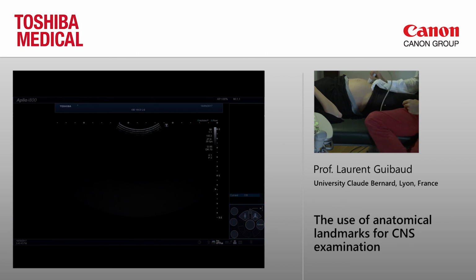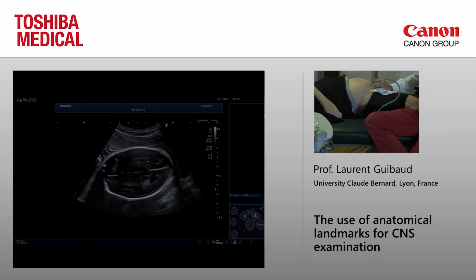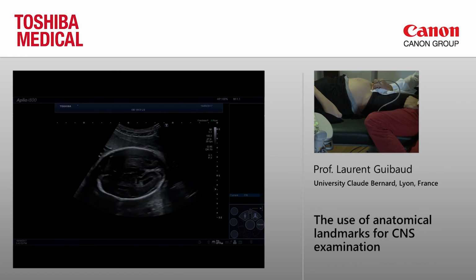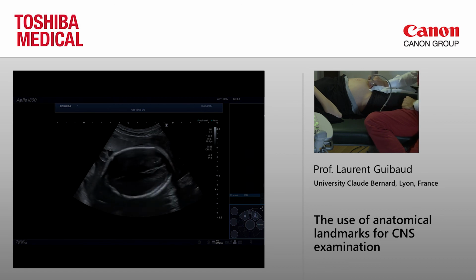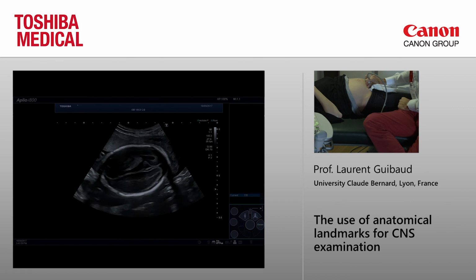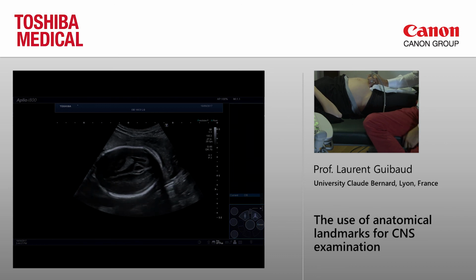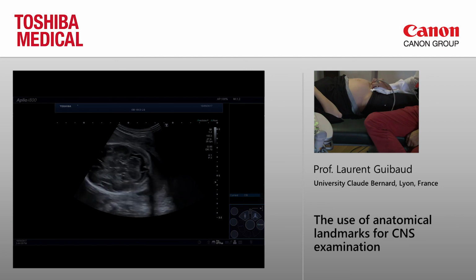So in many cases, when some very good operators want to be sure that there is no ventriculomegaly, they try to see the ventricle, and say, yes, I see the ventricle, and it's a borderline ventriculomegaly. But it's just, in fact, a false image because of the oblique image.